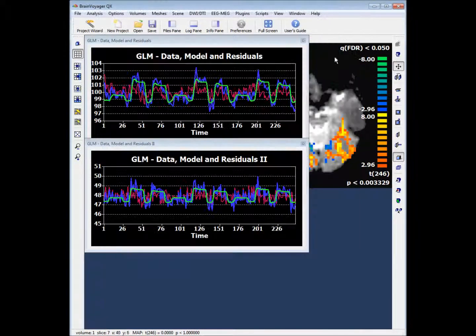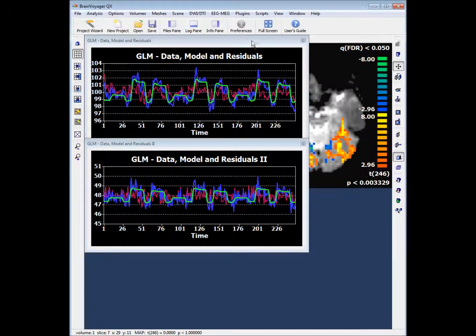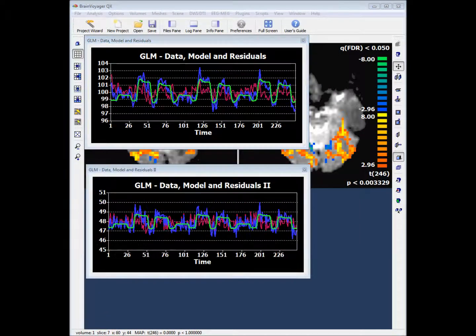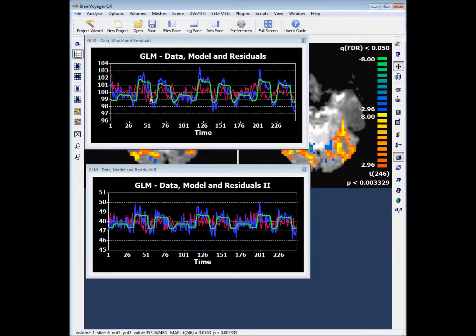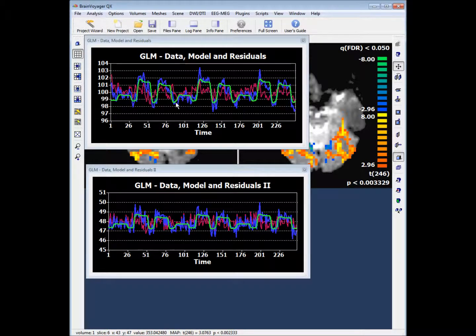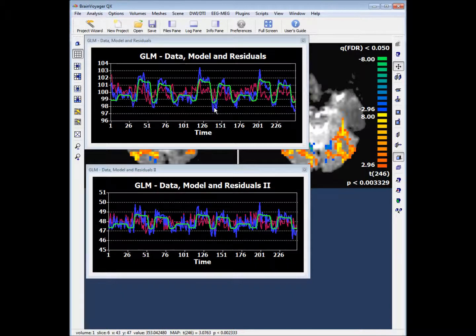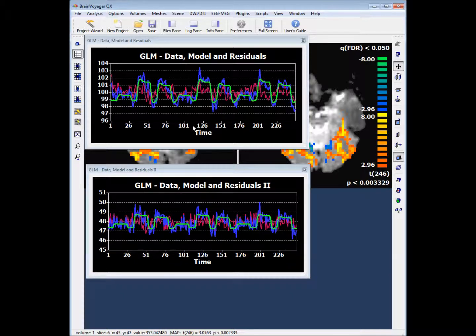We also have two plots. The first one is without corrections and the second one is with corrections. The blue line represents our data plot. The green line represents the fit of our model based on the beta weights of our predictors. You can see that it follows our data plot quite nicely but it's not quite perfect. The red plot represents the residuals. This is just subtracting our fitted model from our data.